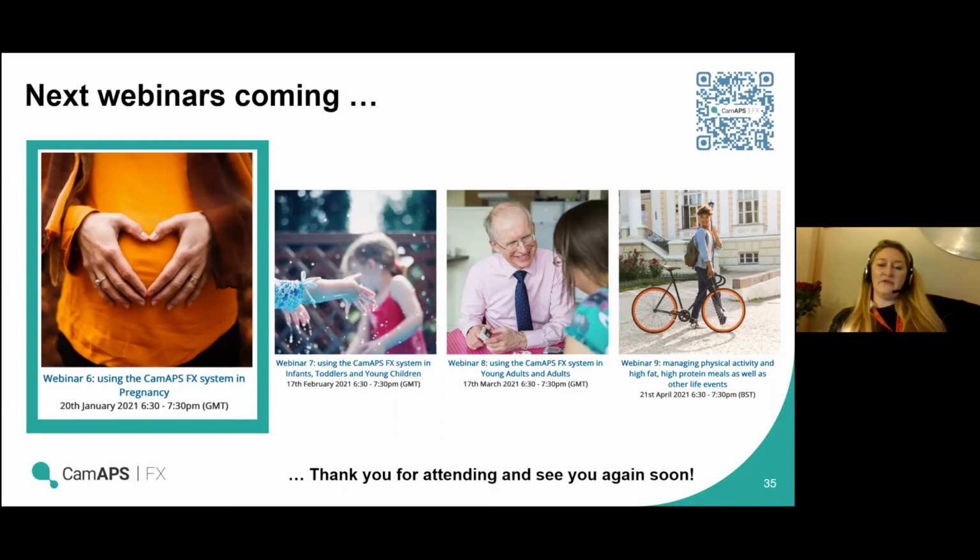But if you turn the phone on its side and you think, well, it's 4 hours since I had lunch, the system's backed off for the last hour and a half because it could see I was dropping, and when I look at the rate of fall, I feel like I'm going to flatten out, then depending on the direction arrow, you might wait and watch, like Charlotte said, or at least not overdo things.